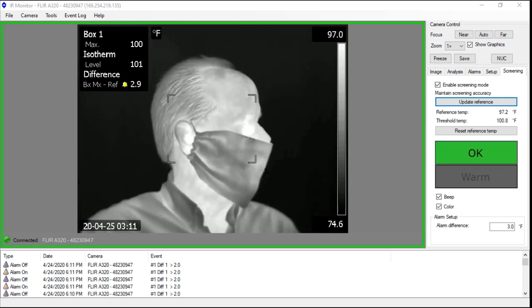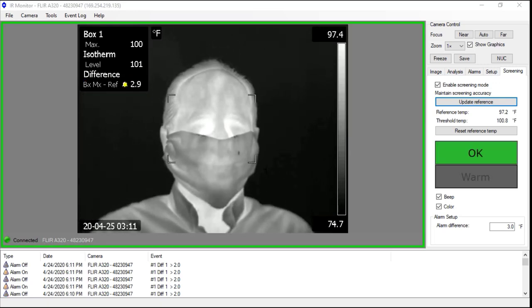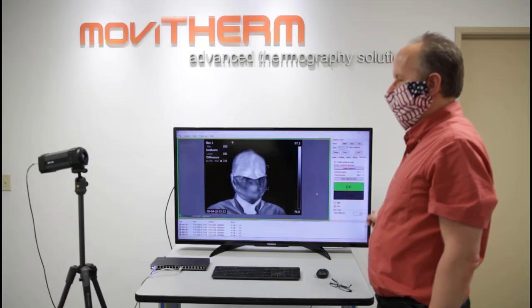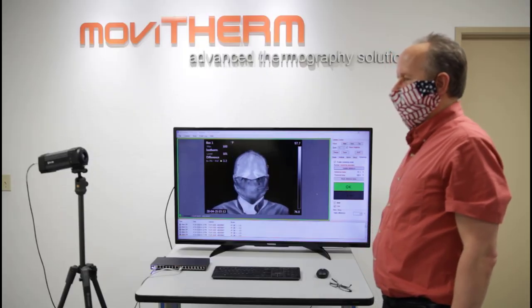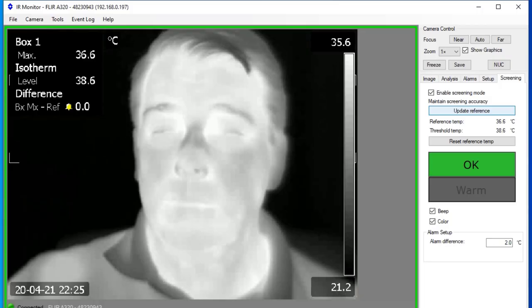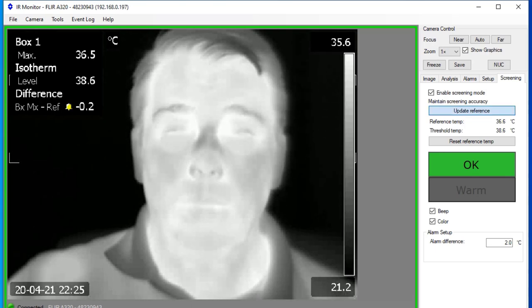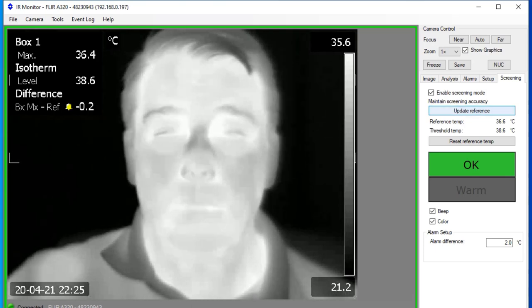And you see a red frame in the image and the warm button. The way you set up the FLIR A320 Tempscreen Camera is by building a baseline population.